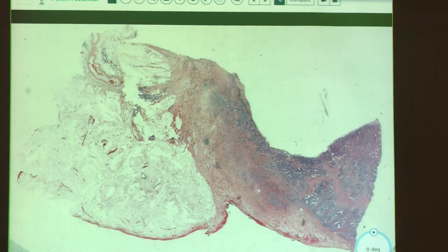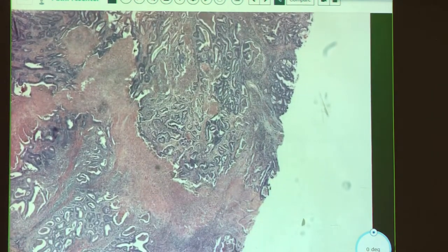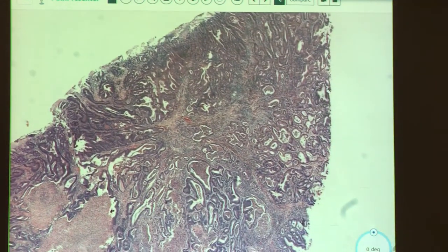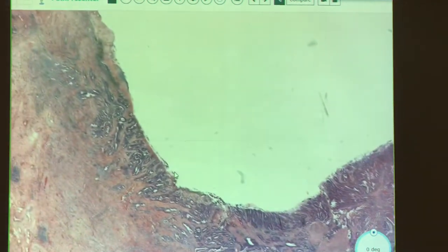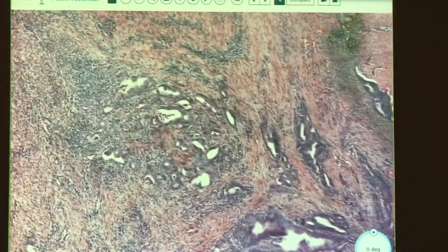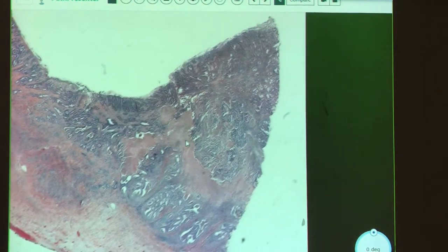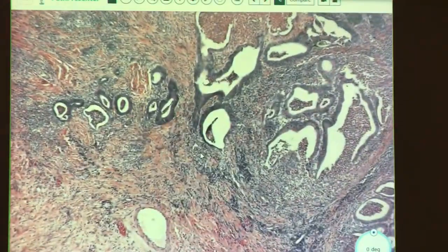Case 7. There's a lot going on — very glandular, distorted architecture with too much crowding. The glands are not forming in an organized way — there's inflammatory reaction to them, very blue with lots of cells. This gives the general feel of some sort of tumor forming glands — probably an adenocarcinoma of some sort. Zooming in on individual glands, these are not happy nuclei — pale with chocolate chip chromatin. There's also dirty necrosis — fibrinopurulent debris — a term we like to use in GI. These are cancerous cells — an adenocarcinoma.